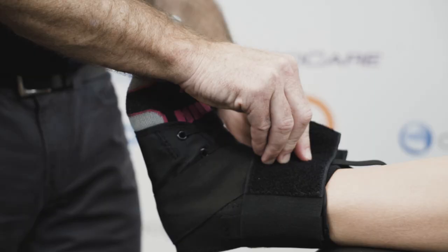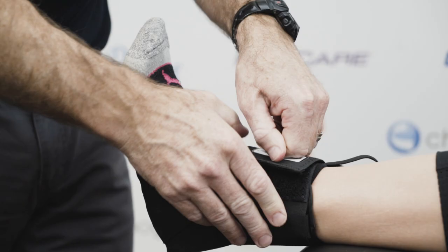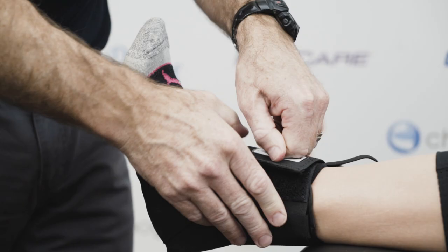Then it's quite simple — we lock off those two straps with a thicker, shorter strap, pull it across, and you've got easy application of the ankle brace.